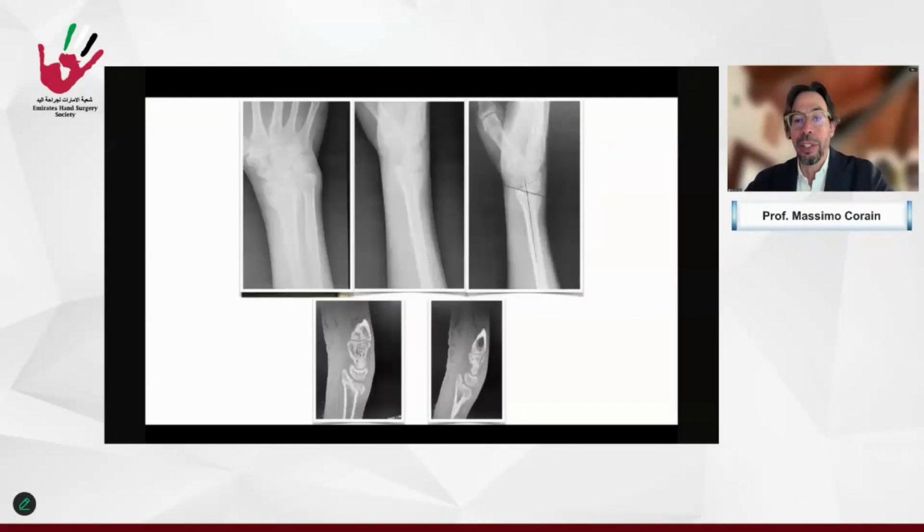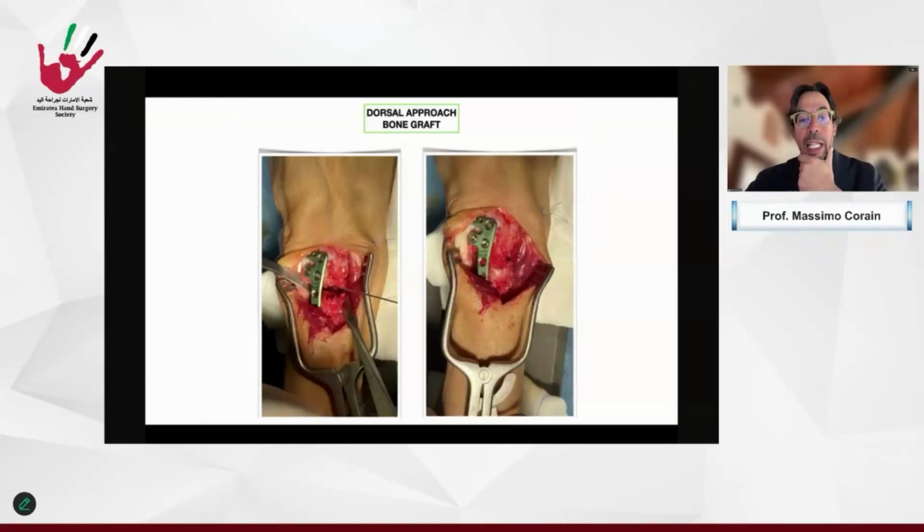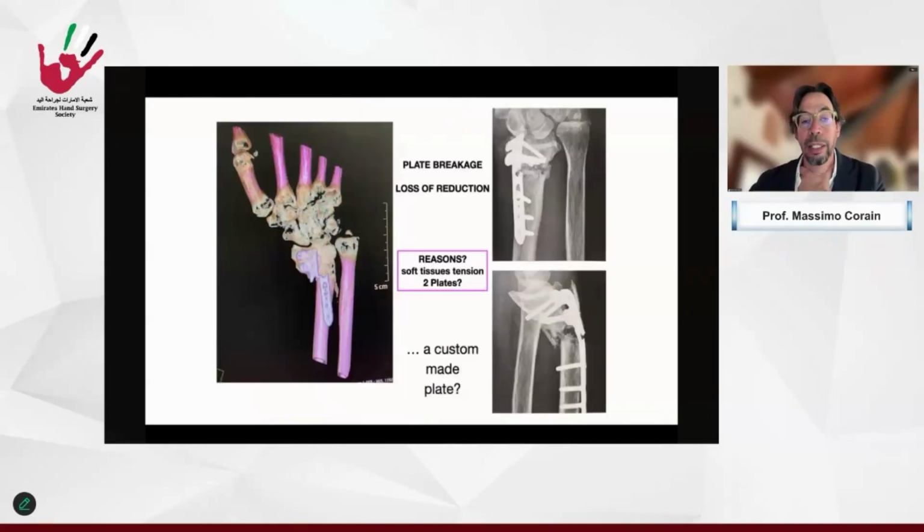This is a patient treated some time ago with a reverse tilt of the radius. So we can draw on the X-ray to try to understand the deformity. Looking at the X-ray and the CT, this was approached by a dorsal approach with bone graft and a standard long dorsal plate that in 3 weeks went to breakage with loss of reduction.